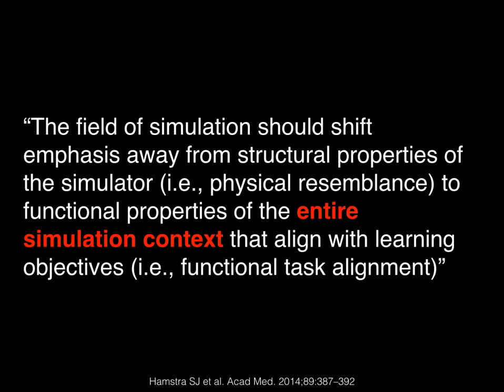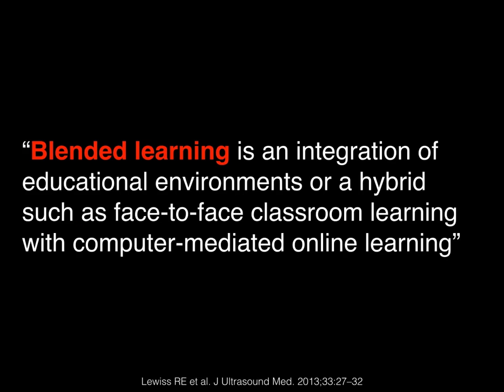Are you trying to accomplish scanning normal anatomy and recognizing normal anatomy and protocols, like on real volunteers? Are you concentrating on peripheral IV placement and don't necessarily need an ultrasound simulator but a task trainer? And then this brings it back to what Risa was talking about in her article, that blended learning is the integration of all these educational environments. And so you need to combine different things in order to have the right learning environment. And simulation is just one part of that. That's not the only part.